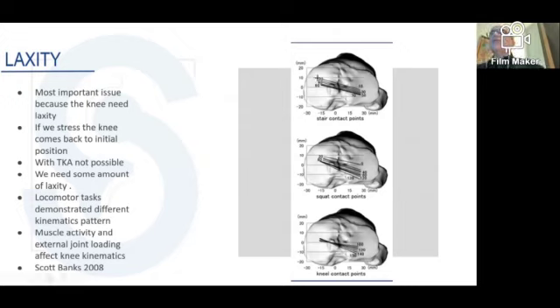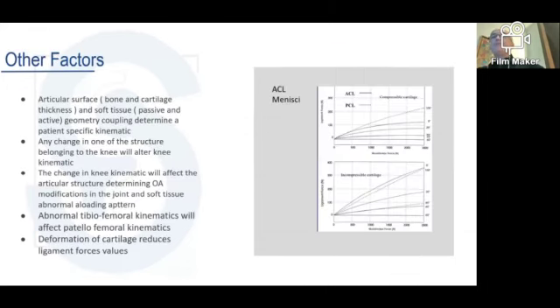It's almost the same. On the other hand, when you see the lateral plateau, the more you flex and you squat and you kneel, the axis goes back, and it means that the lateral tibial plateau is going posteriorly and the femoral condyle anterior to the tibial plateau. Now there is more movement in the lateral part, and we will explain later on what is the importance of more mobility in the lateral part of the tibial plateau than the medial part of the tibial plateau.